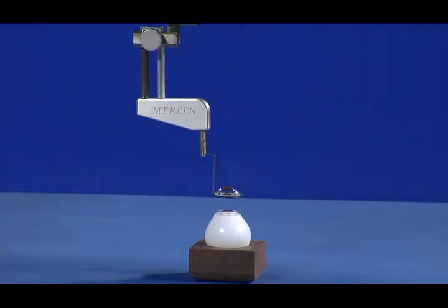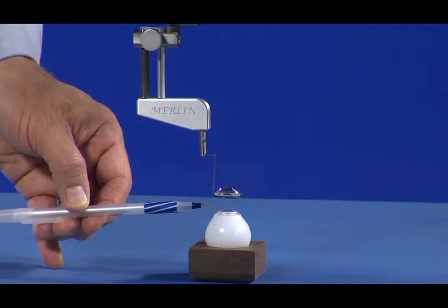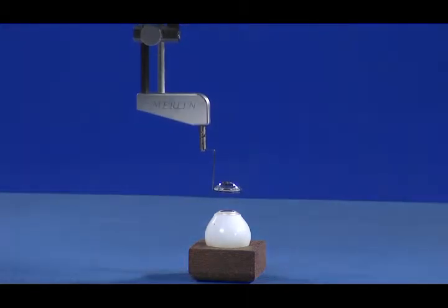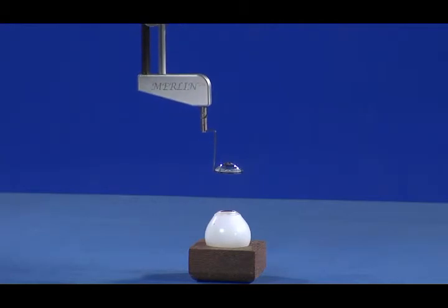Optimal location for the best field of view with any of the three lens models is about five millimeters, or about a quarter inch, above the cornea. However, the distance of the lens from the cornea is always at the physician's discretion. Note that the further away the lens is from the cornea, the smaller will be the resulting field of view.